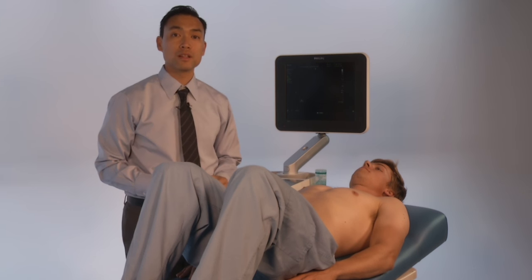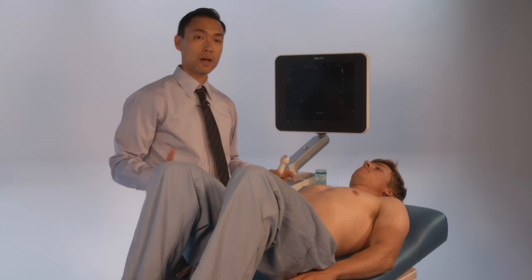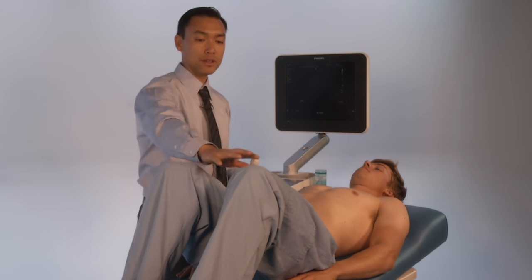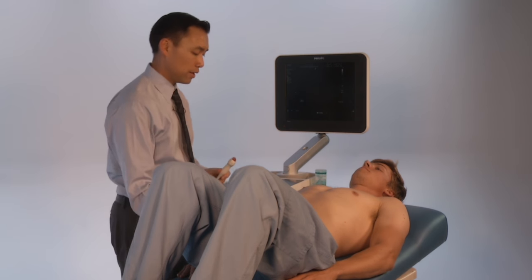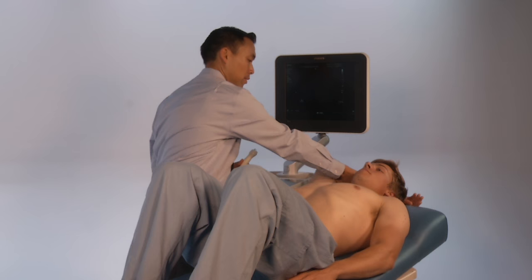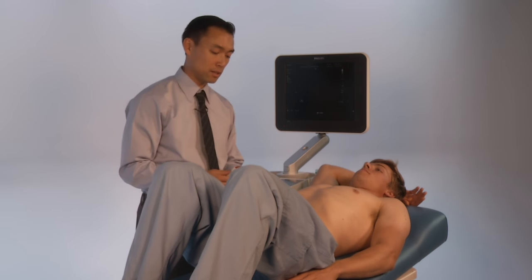Now we're going to perform the liver ultrasound. For liver ultrasound, you want to position the patient in the supine position. Their legs are going to be bent to relax the abdominal muscles. You can position the patient's arm above to expose the ribs and open up the rib spaces to look for the liver.